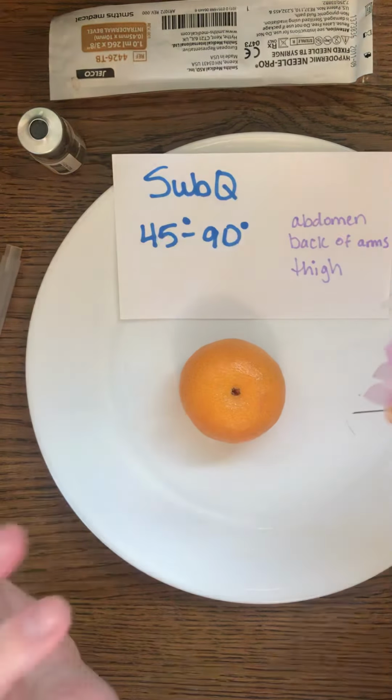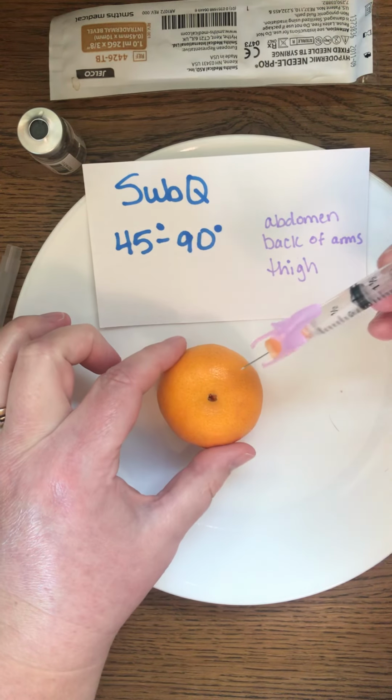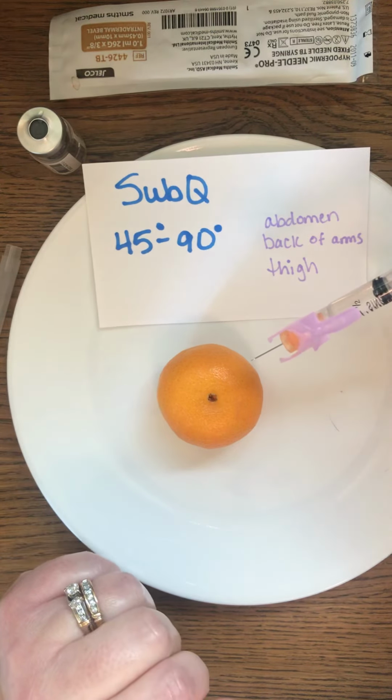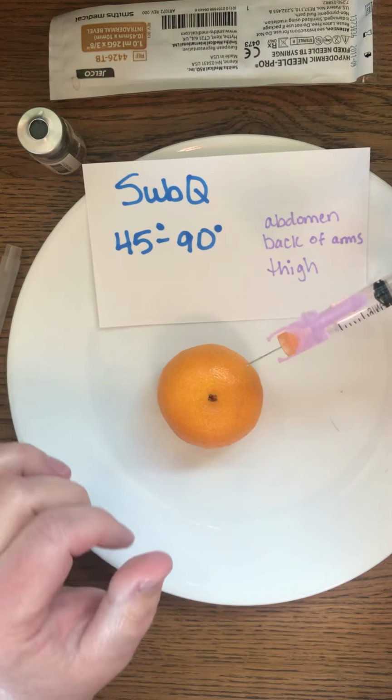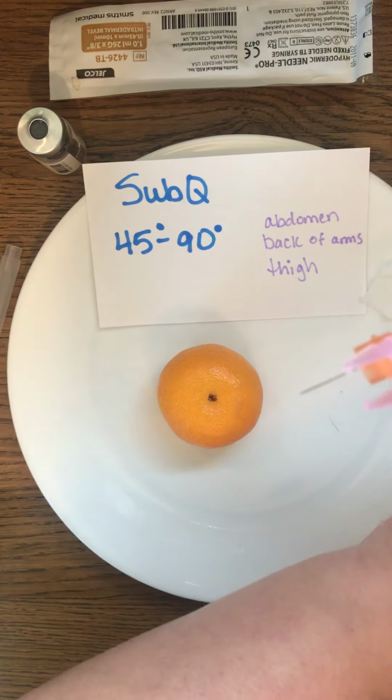And again, we can pretend that's the belly button, that's the umbilicus, so we're going to avoid that. Obviously, we're not going to be able to avoid it by 2 inches, but we are still going to avoid it. Again, if we're doing a 45-degree angle, we do also still want to worry about the bevel. So we want to make sure the bevel is up.